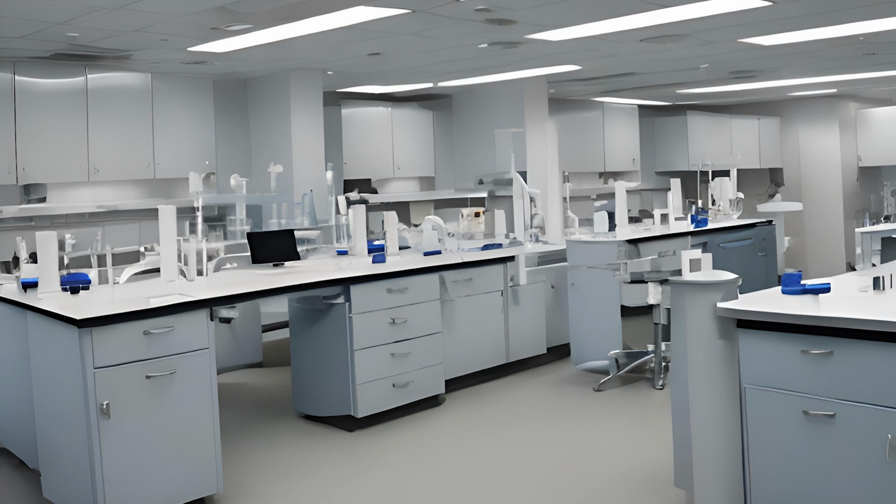Their profession may train them to do that. We all have our own professional methods for doing this. Ours is to not recap a needle. Other specialties may be different. Apply pressure to the site for 3 to 5 minutes or until the bleeding stops.